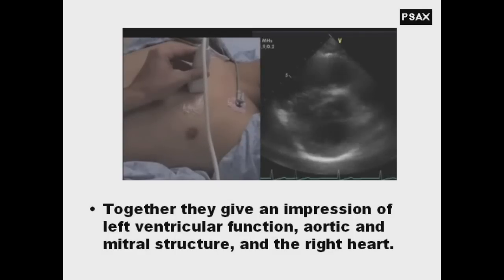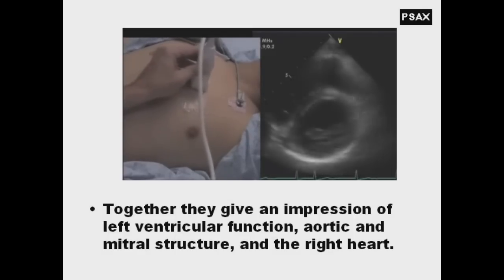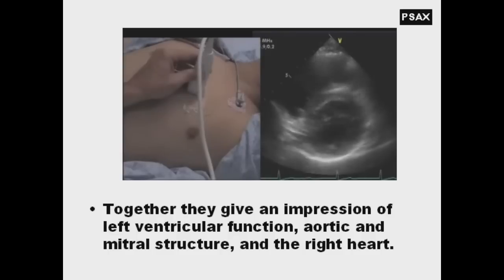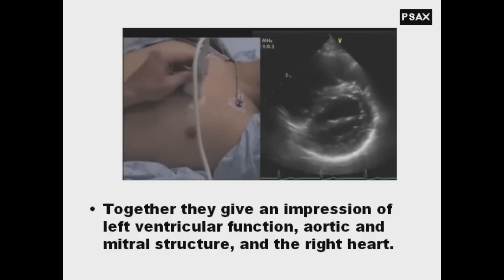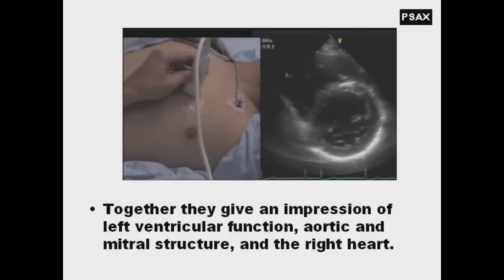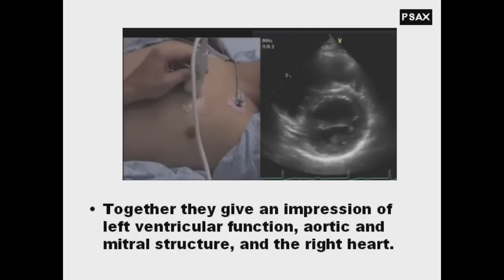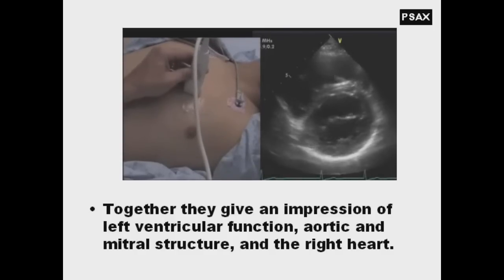Short axis view, because you won't be seeing the chambers that you expect you should be seeing. So in this case, here we have a perfect mitral valve. The best place to check for how round you are is with the mitral leaflets. So we can see both leaflets across. They're horizontal across the screen more or less, and they're completely parallel to one another.